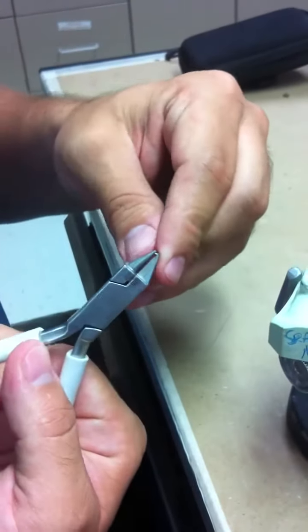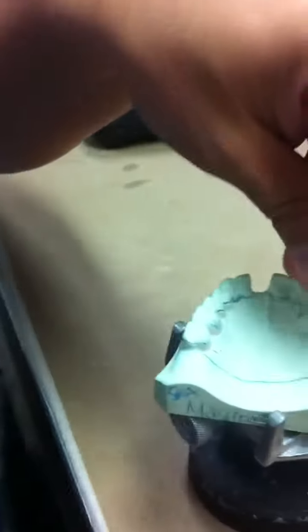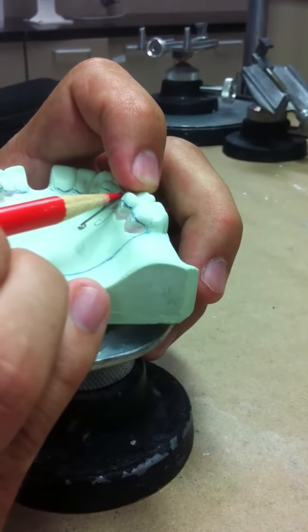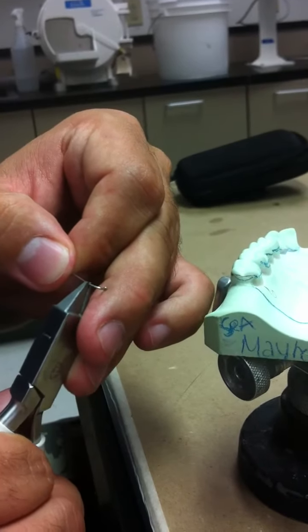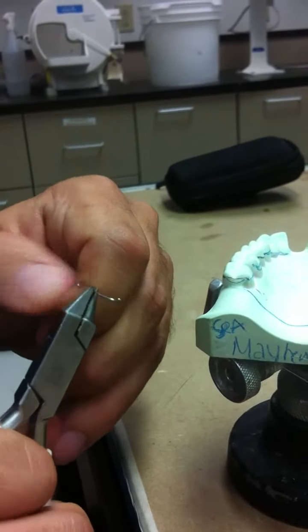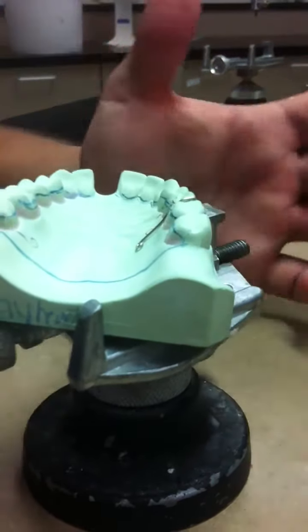Next we make the retention loop. Take your pliers and circle the end of the palate. Slight bend, lift off palate, and that's how you make a ball clasp.